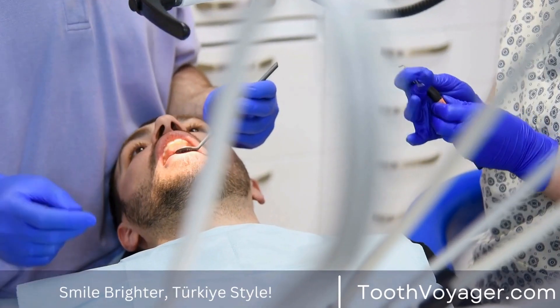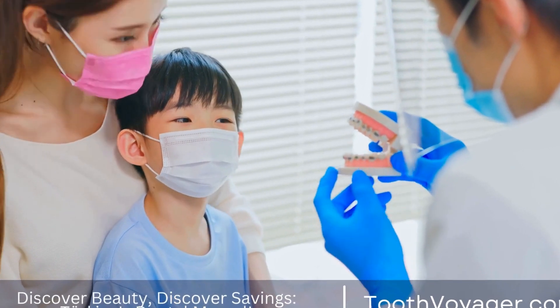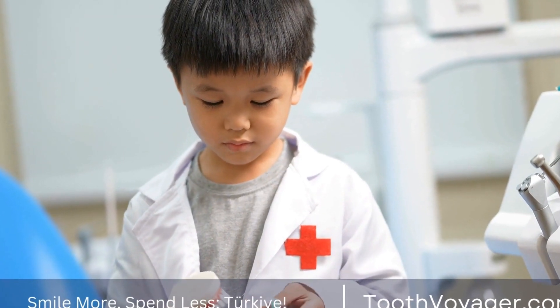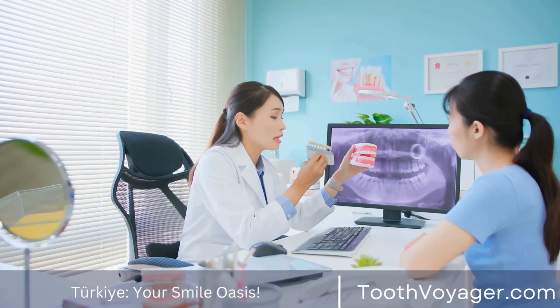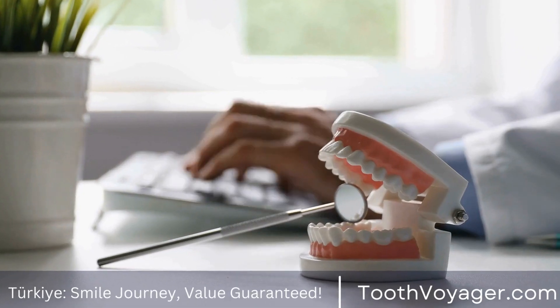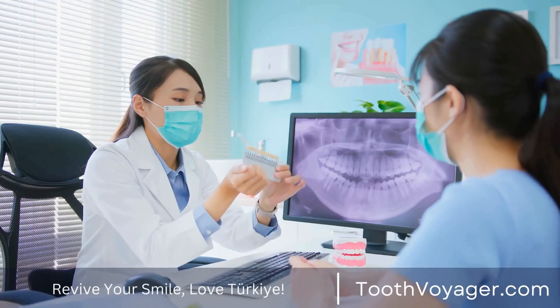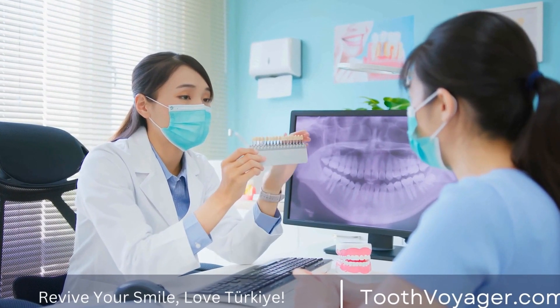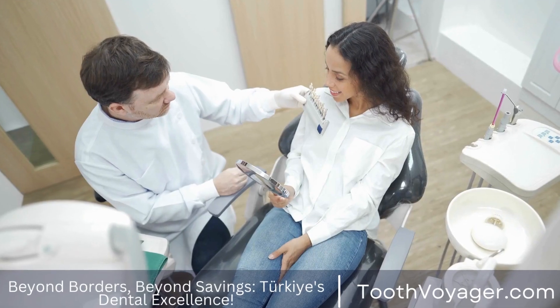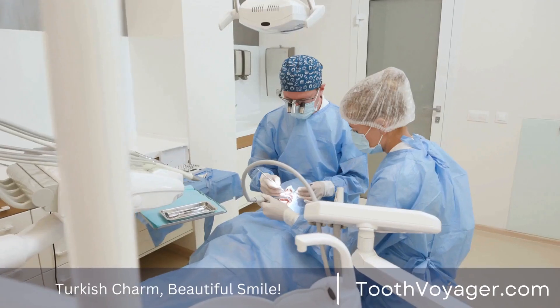The Art of Shade Matching. One of the most crucial steps in crafting a custom dental crown is shade matching. The crown must blend seamlessly with the patient's natural teeth for a realistic appearance. This requires a keen eye for detail and an understanding of color theory. Dental technicians will use a shade guide to determine the exact color of the patient's teeth, then mix and match different shades of dental ceramic to create a crown that matches perfectly.